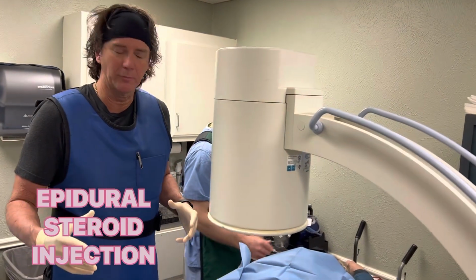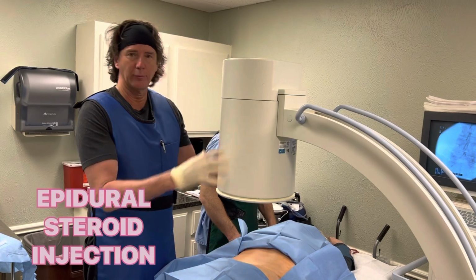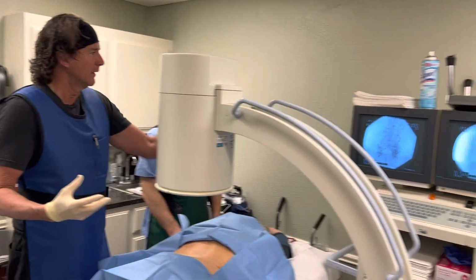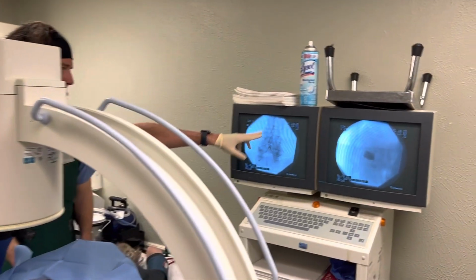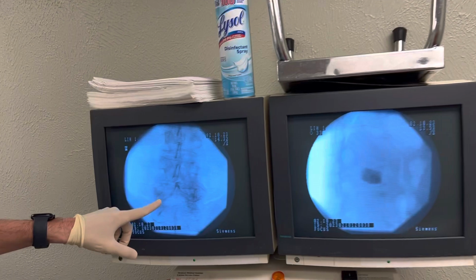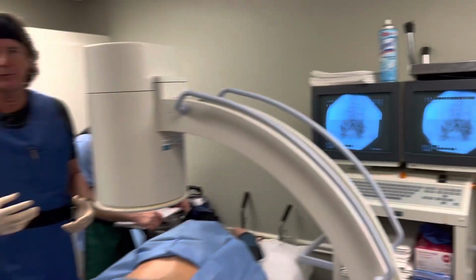Okay, we're set up here for the epidural steroid injection. This is of the lumbar spine. We have the patient exposed, the area where we're going to do this. This is the fluoroscope, which is the live x-ray machine, which lets us see the image. Toby will show you on the screen here. We're looking at the lumbar spine, like the model I just showed you. We're trying to go into this space right here. We go into the space where the most narrowing is, and in her case, that's the space.